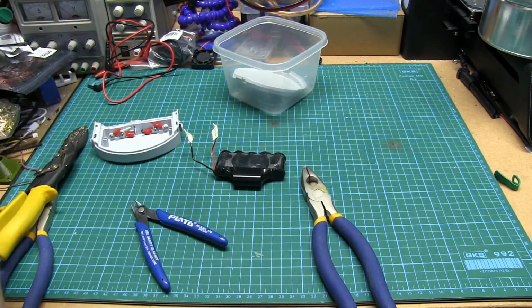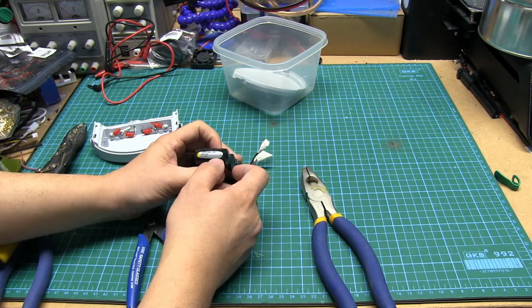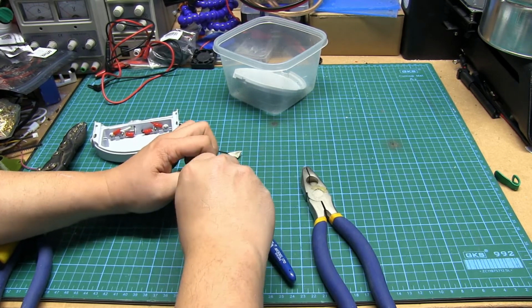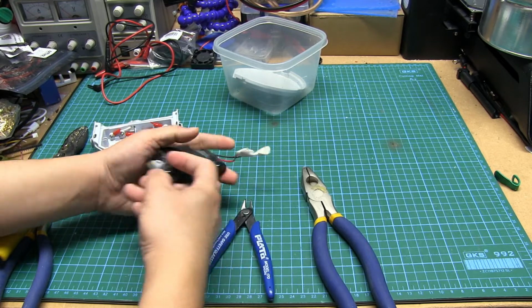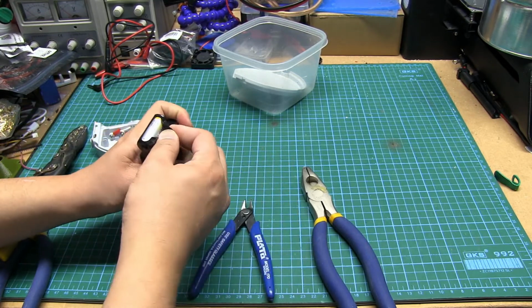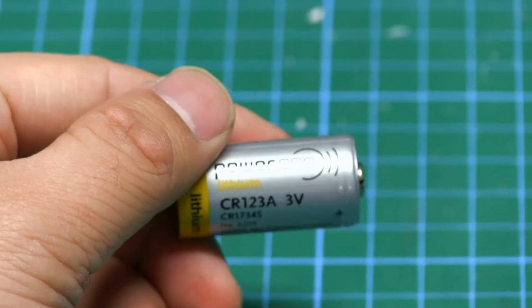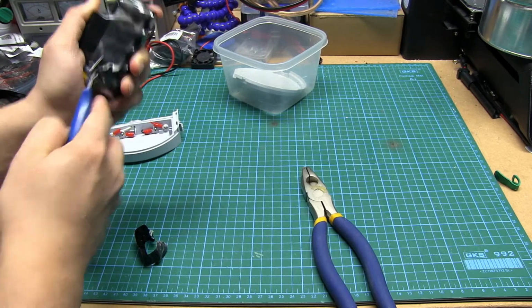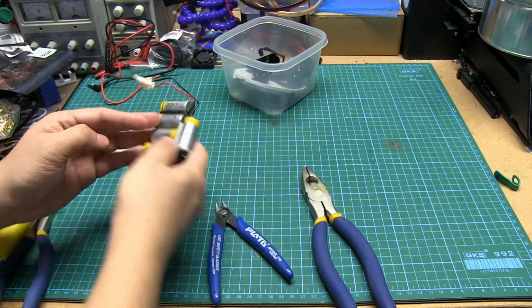Alright, put some of this away, I don't need it anymore. Okay, so we've got CR123As, like we expected. Let's ever so carefully snip the heat shrink wrap. See if we can't dig further into this. What brand is this? Because it doesn't say on the outside. Power One Lithium. Alright, there's the plastic heat shrink wrap gone. Let's see what we have.